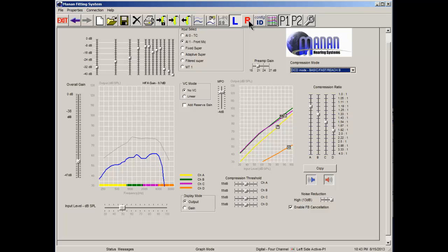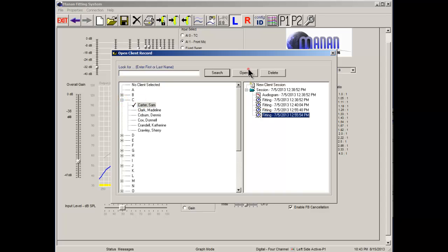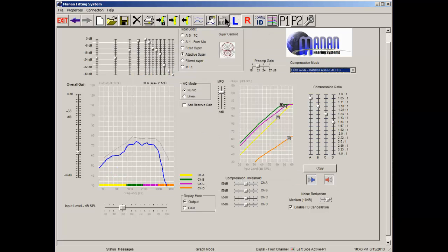And so to get data into the right ear, you would go in, open up your file, click open, go through the glitch, and then you would immediately go to the right side and load that. And this information that's displayed for the right side is the data that you pulled in from the database. You would load this and lock this, and that actually wipes out the data for the left side. And I think the reasoning why they've done this is that some people may have data points on this date that they want to pull in for this hearing aid, and then they may have a data point from a different date that they want to pull in from the other hearing aid. And so you actually have to go through it twice if you're wanting to restore both hearing aids back to a data point.